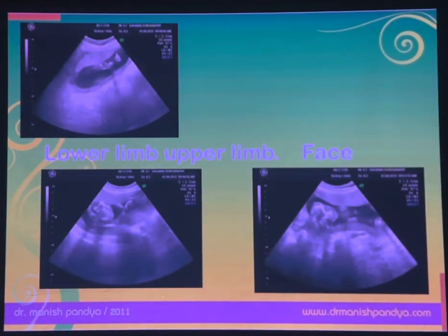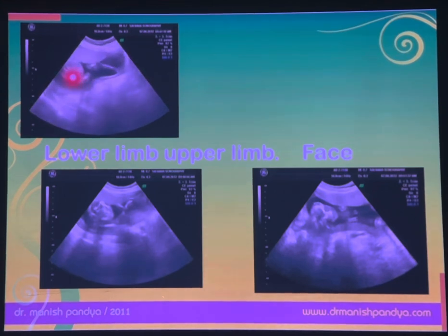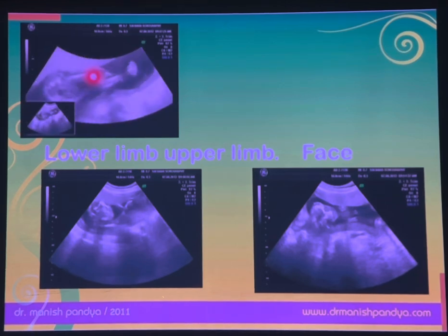Now see the video. This video shows you the lower limb. You can see. First you are able to see the femur. Okay, this is the femur, and again I am saying always measure the femur which is near to the probe. Then usually the baby lies in Krishna position. Always crossed legs. Then in the leg you have to see there is an angle maintained between the foot and tibia fibula. Now you zoom it.